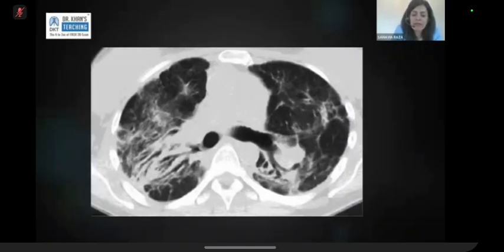And the way to remember it is when you have a CT chest and it's a supine scan, what you want to look at is when it's sarcoidosis, it's upper to mid zones, and it looks like somebody has taken the bronchi and they have pulled them back. So like if somebody was standing in front of you and facing the other way and you took their arms and you pulled them back, that's how it looks like when you look at the lung. It looks like there's somebody pulling it back laterally.